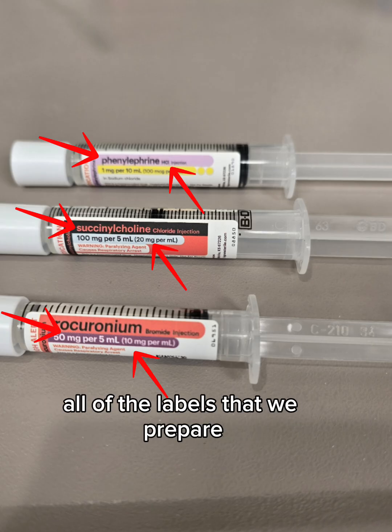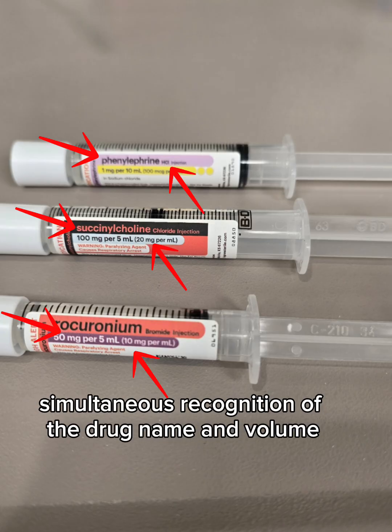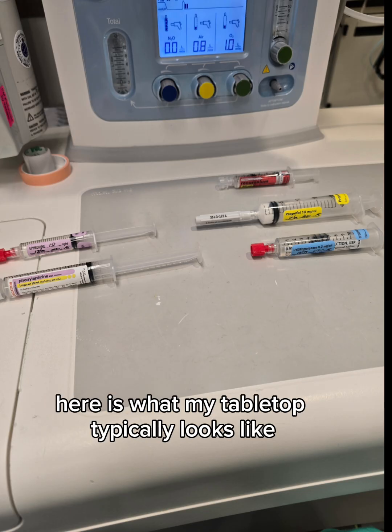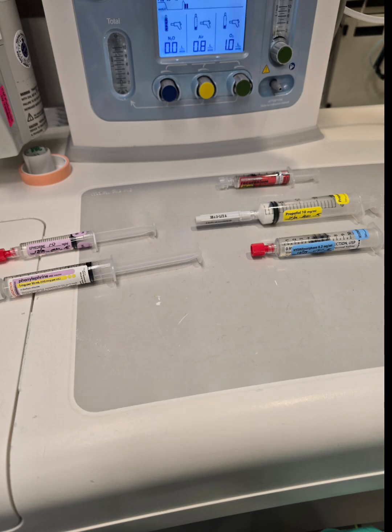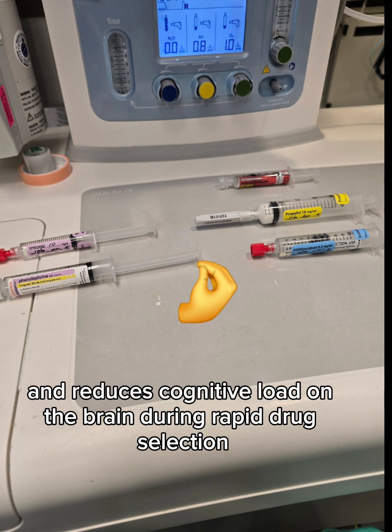All of the labels that we prepare for our syringes must allow for the same simultaneous recognition of the drug name and volume, and we should also make sure we include the concentration and a date and time that we prepared it. Here's what my tabletop typically looks like during the maintenance phase of a case. Notice how my labels all have uniform orientation. This consistency helps with quick identification of syringes and reduces cognitive load on the brain during rapid drug selection.